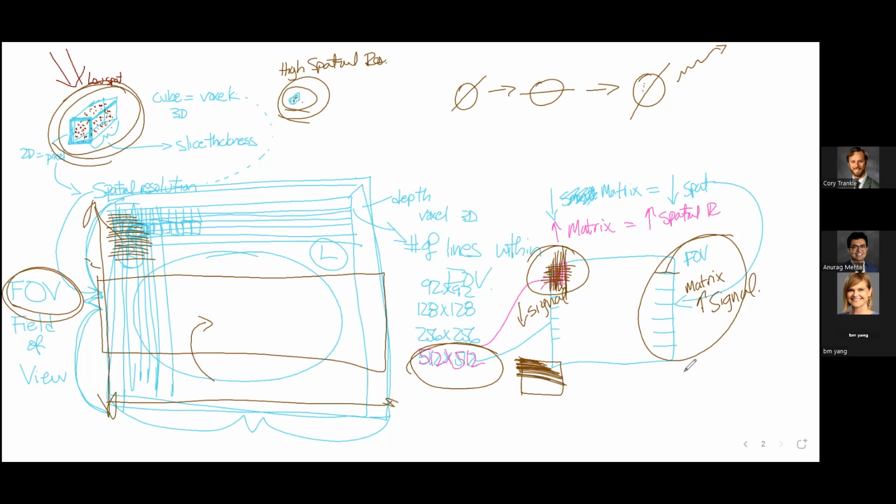This is something you should know about. You remember Mr. Obama activated a program. They wanted to be able to see the dendrites in the brain. So what did they do? They went from 3 Tesla past 7 Tesla to 10 Tesla. Remember, winding, unwinding. We're winding them tighter. There's more energy release. That allows you to really crank the matrix and get high spatial resolution.